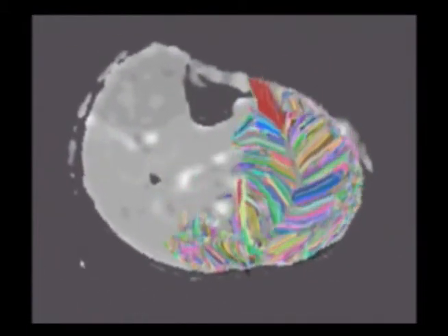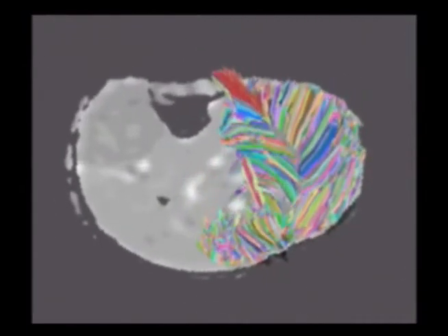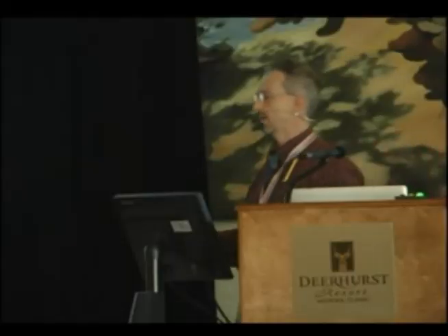Okay, and then if we look at the other leg here, where it's more of a tear in the muscle. You can see it. The muscle's all beat up right here. It's all been shredded. Someone hobbled in. This was someone that runs to Brantford every day. So from Hamilton. Okay, I said, well, maybe no, don't do that.